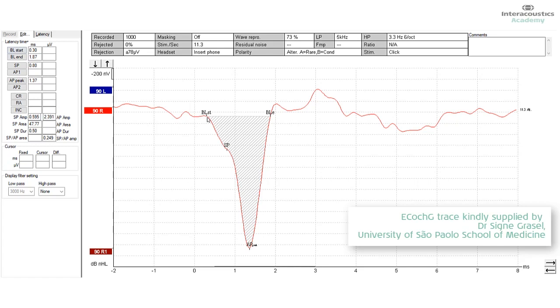And then the special software is designed to take that straight line that we've just created between the SP beginning and the next point where the amplitude is the same place as where the SP began and measure the area under the curve. And that's what we will call the SP area.